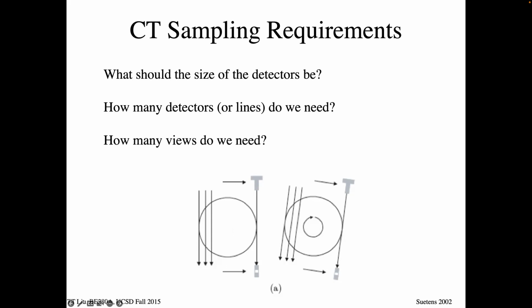And if you've been messing around with the MATLAB script that I sent out and tried reconstructing a picture with, say, 12 angles, you can see what the result is, as opposed to using 300 or something sensible. With the sampling rate in l, in the early incarnation of CT, we had a source and we rastered that source across the patient and sampled the attenuation of the X-rays with a single detector as we went across.